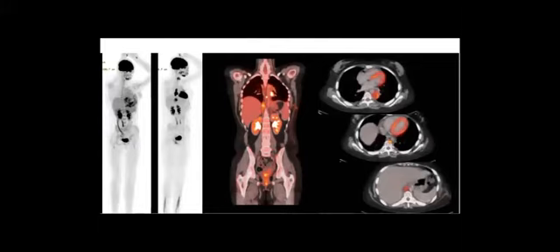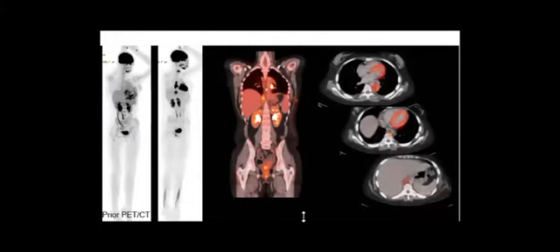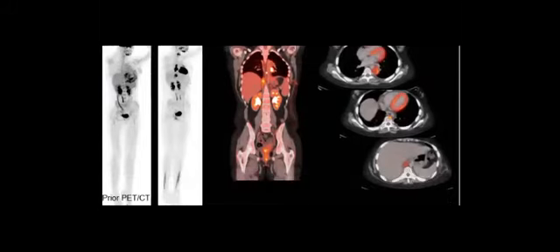I will ask you just one question about this. This is another case. So, what is the difference between this one and this one? What happened? Nirmin, revise again. It's okay. So what happened in this patient? What do you think about the change that happened here? What is the difference? Try to pick up the difference.